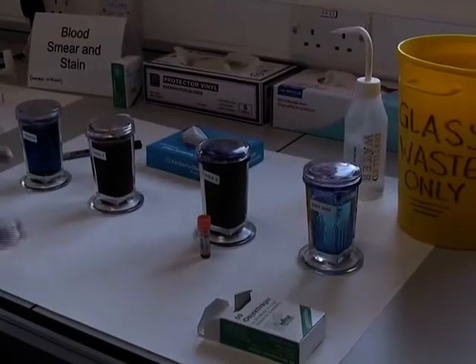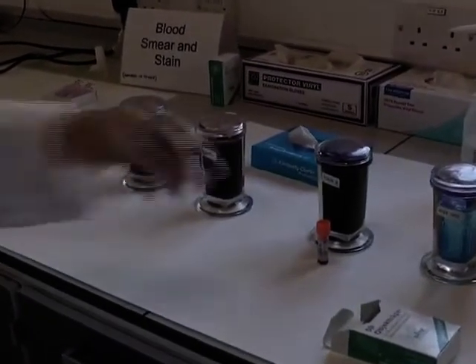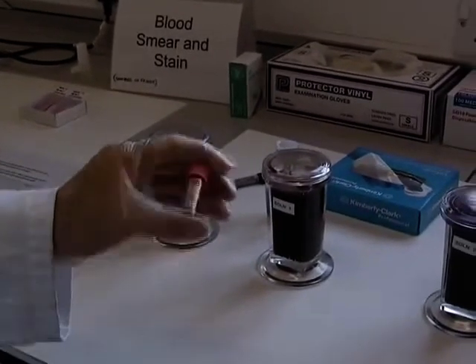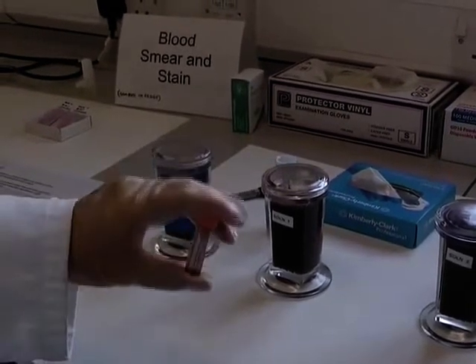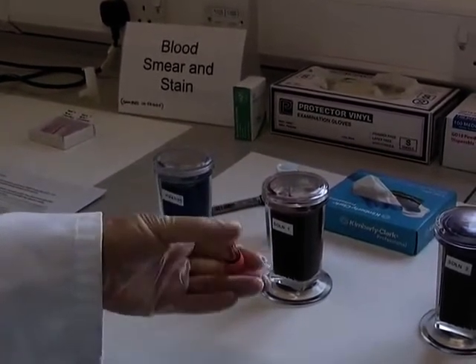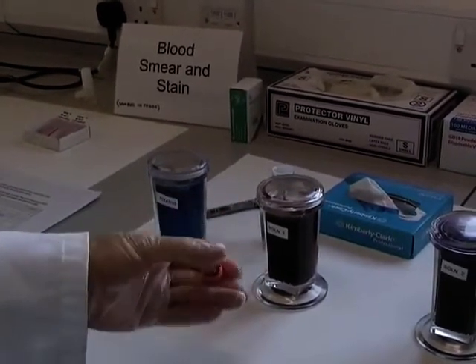For this demonstration you will also need gloves. The blood sample will have been kept upright in the fridge. Cells may have settled, therefore it's important to rotate the sample up to 12 times gently in order to mix the cells into a homogenous solution.